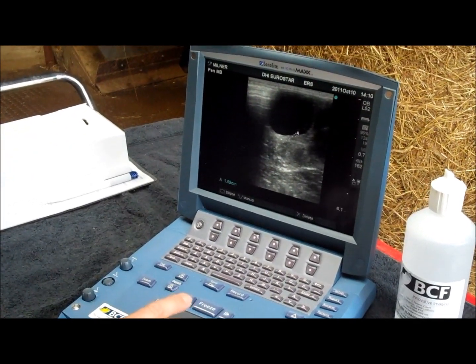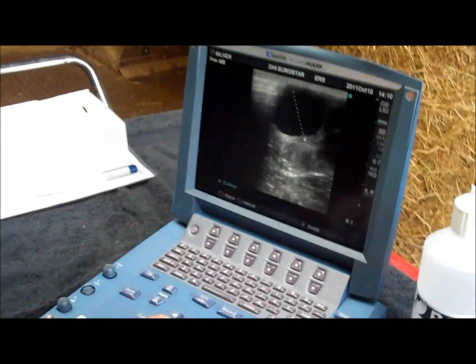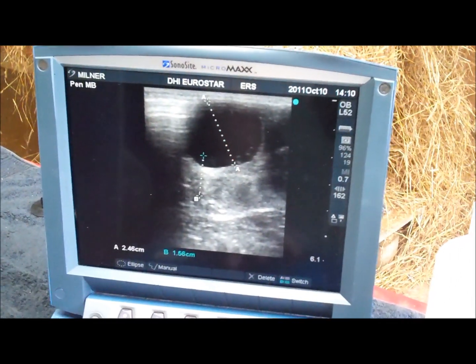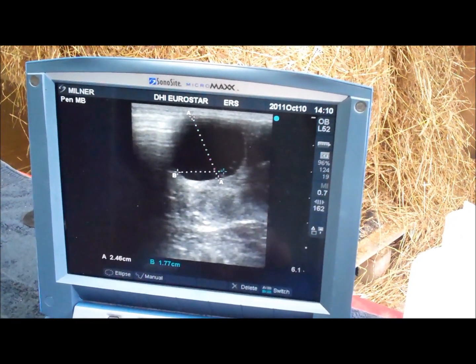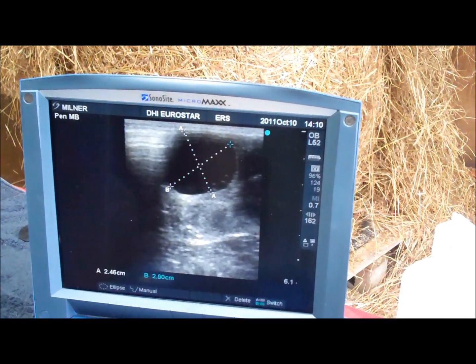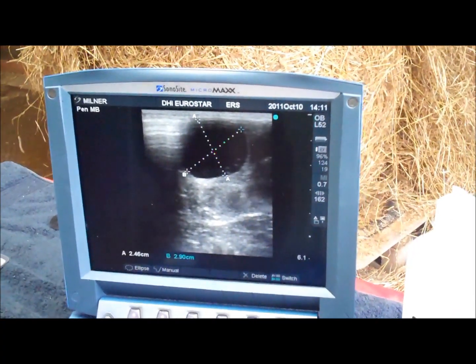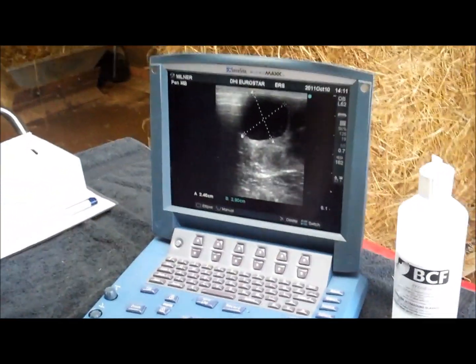Select one side of the follicle, move the other side of the caliper to the other side of the follicle. Select, and we have a measurement. We can take multiple measurements using the caliper function — we can get multiple dimensions of this follicle. And literally, to save an image: Save. And we save for future use.